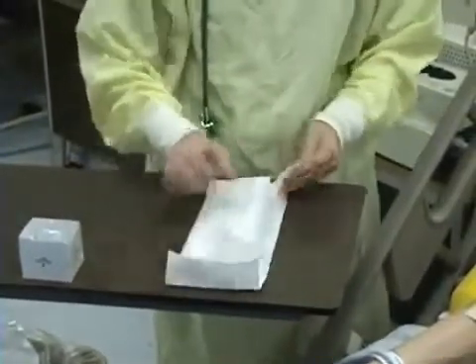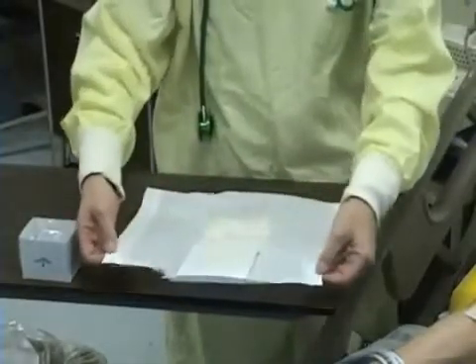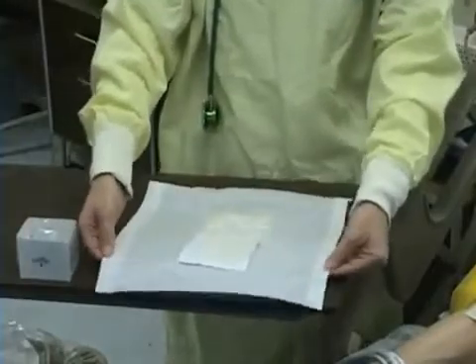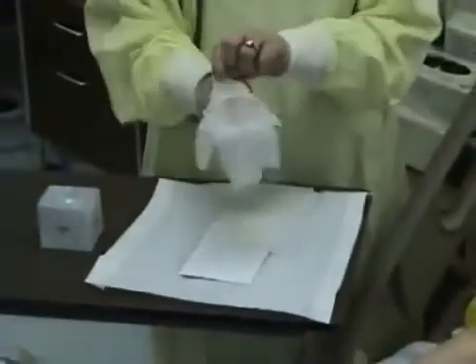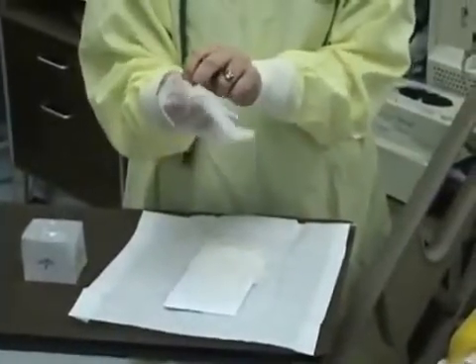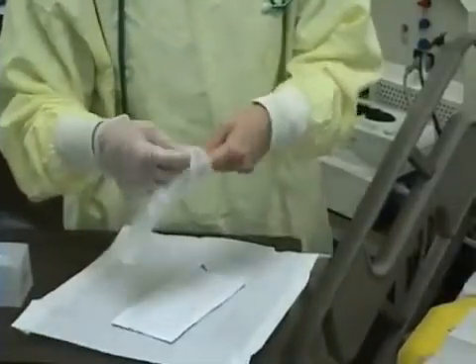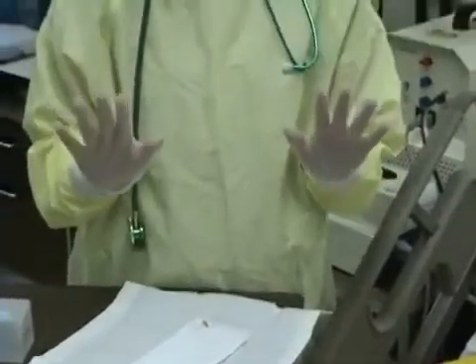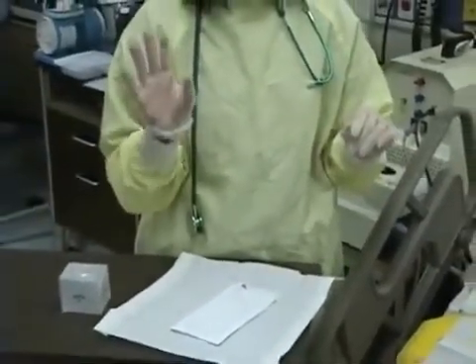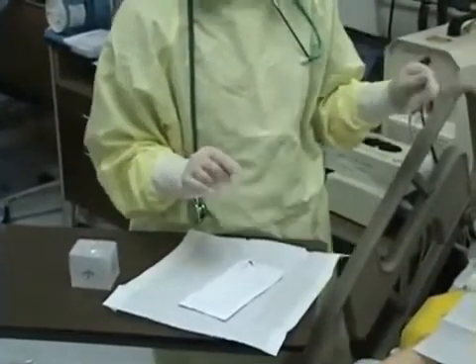Now I will go ahead and open my kit. I'm opening my kit in a sterile fashion. It's in front of me. I'm only touching the 1-inch border of my packaging. I will don my sterile gloves. Now my hands are sterile. Because I'm right-handed, I will designate my right hand as my sterile hand and my left hand as a non-sterile hand.